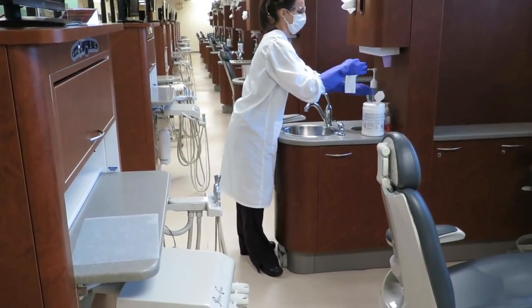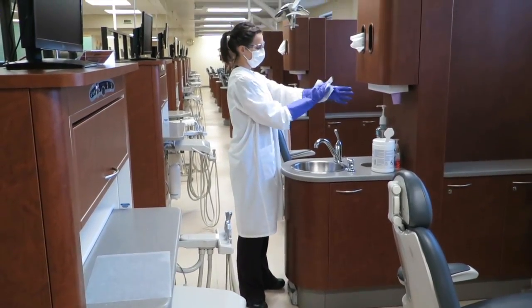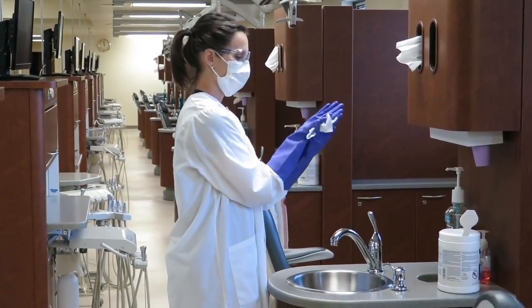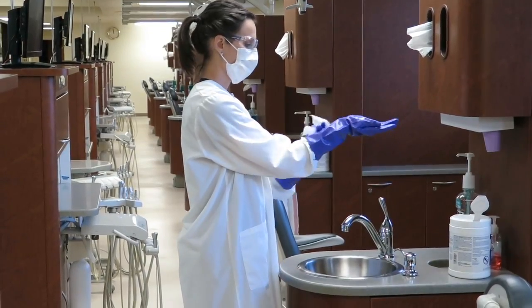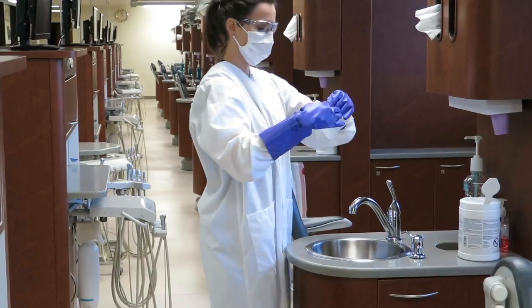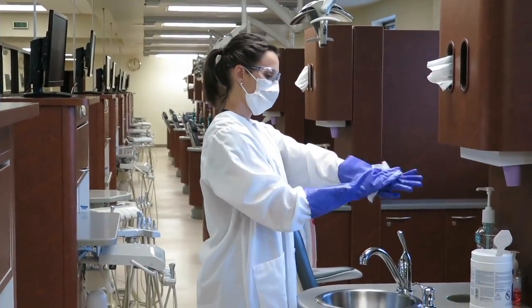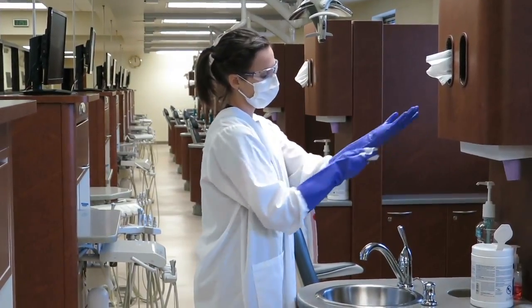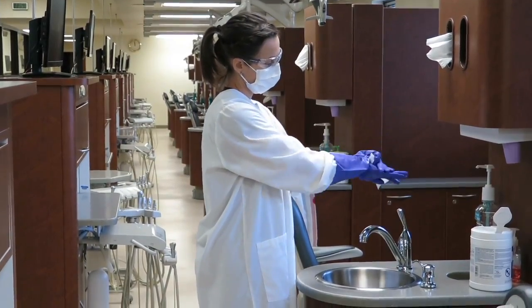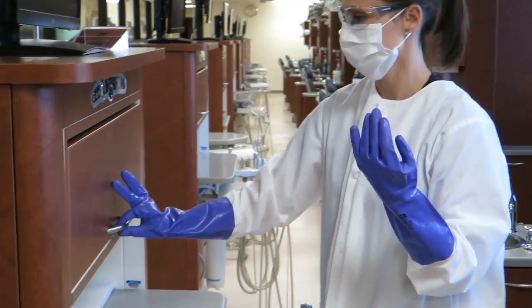Once you have disinfected all items in your cubicle and on the bracket tray setup, you will need to clean your nitrile gloves. You will do this as a two-step process where you will clean and then disinfect your gloves. Place your nitrile gloves in your cabinet behind the patient chair when you're done.